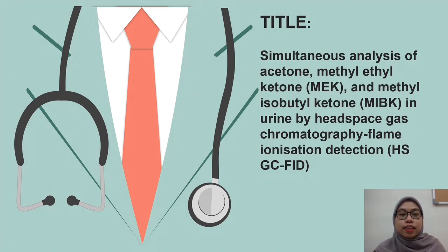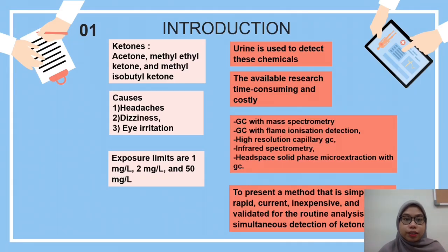The title of our case study is Simultaneous Analysis of Acetone, Methyl Ethyl Ketone, and Methyl Isobutyl Ketone in urine by head-space gas chromatography flame ionization detection, HS-GC-FID. Let's move to the introduction part.